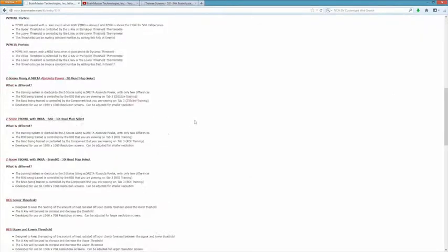You can go and download them down here, and they are complimentary. But as with all protocols coming from the BrainMaster company, these protocol designs and all designs provided by BrainMaster Technologies, Inc. are for demonstration and illustration purposes only. It is the clinician's responsibility to ensure that any designs used provide the intended feedback.